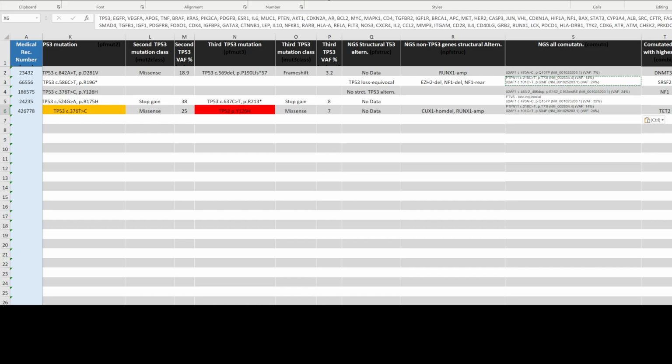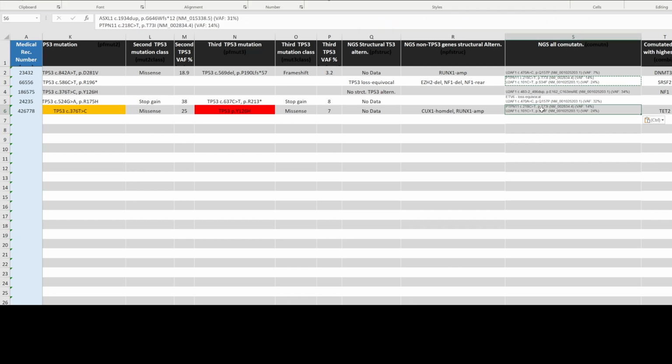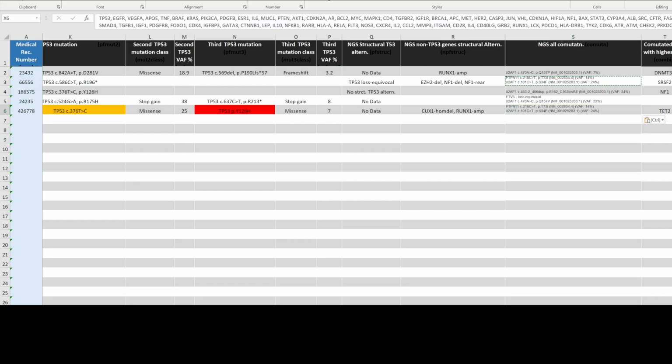And the next column is the entire list of genes being interrogated for that sample and the panel you're using for that, right? This may be the same across, I don't know, a few years, but we keep adding genes down the years into the panel. So I want to make sure that for that specific sample, the gene that we are interrogating is matching up, right? So if you're not interrogating U2AF1 in this panel, so obviously I'll have to make sure that I mark U2AF1 as missing in the co-mutation list if it's not being interrogated, right? So I need to have the data.